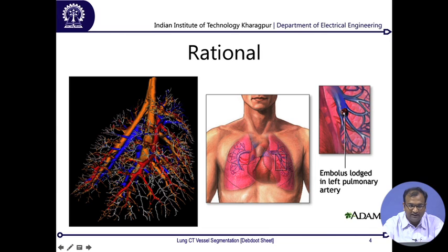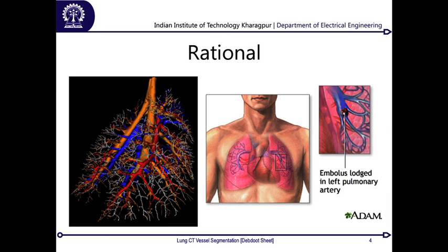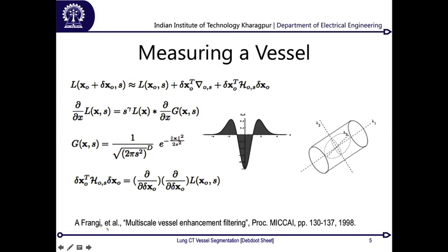So in order to find that, there has to be some way to isolate and associate them in 3D space. This is the challenge which we are trying to solve by medical image analysis. There are millions of such capillaries, veins, arteries, and all sorts of vessels present, and you would like to track and segment out practically each of them, which is not easy to do manually. For that, this particular paper by Frangi was in the MICCAI proceedings in 1998, and this is what it solved.